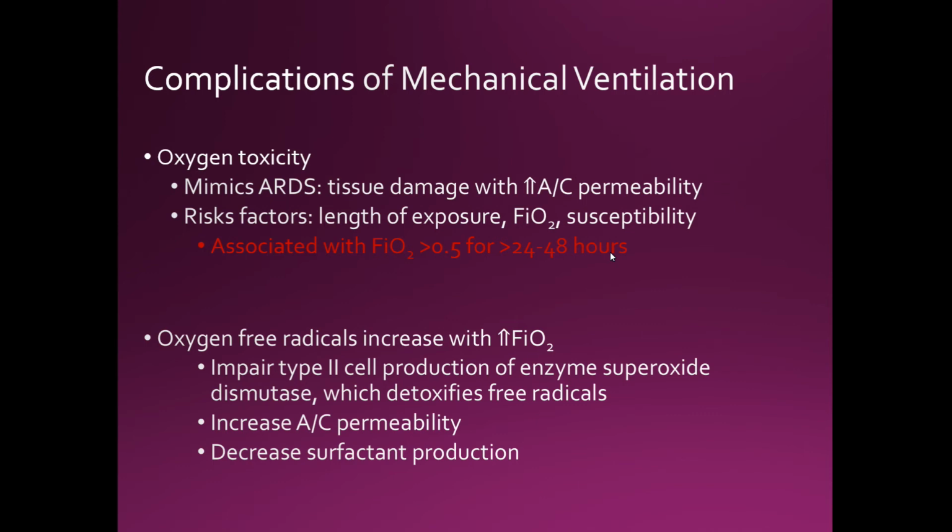Remember, you are nebulizing medication with 5 to 6 liters from the wall unit. That's going to increase a lot of that tidal volume. Now, when they're done, they leave the small volume nebulizer on. That's how you dry a patient on mechanical ventilation. You run oxygen through the small volume nebulizer and you nebulize it throughout the night.